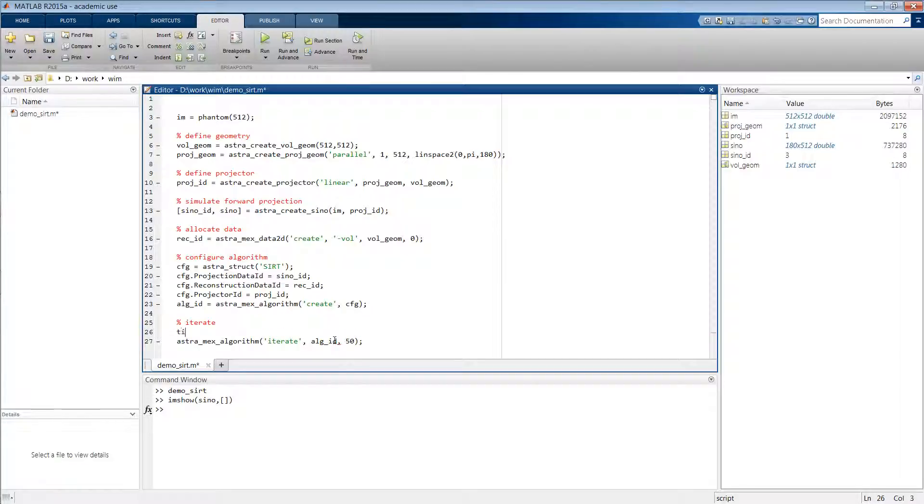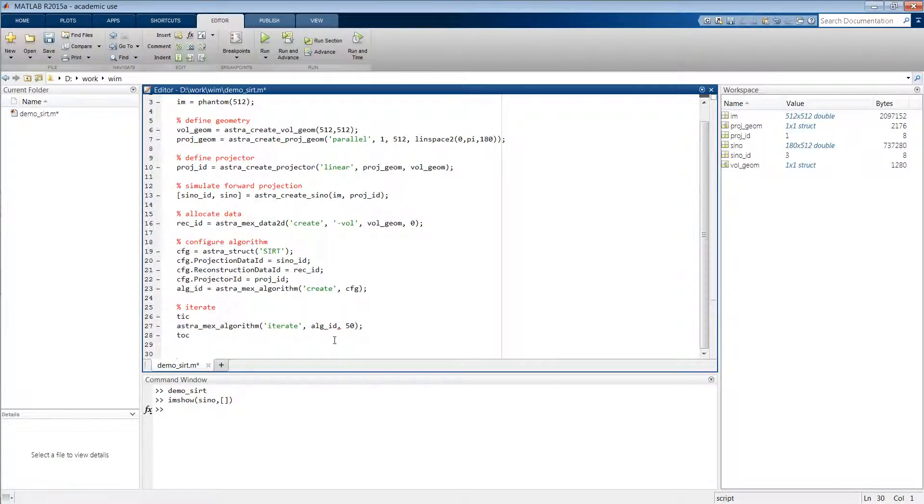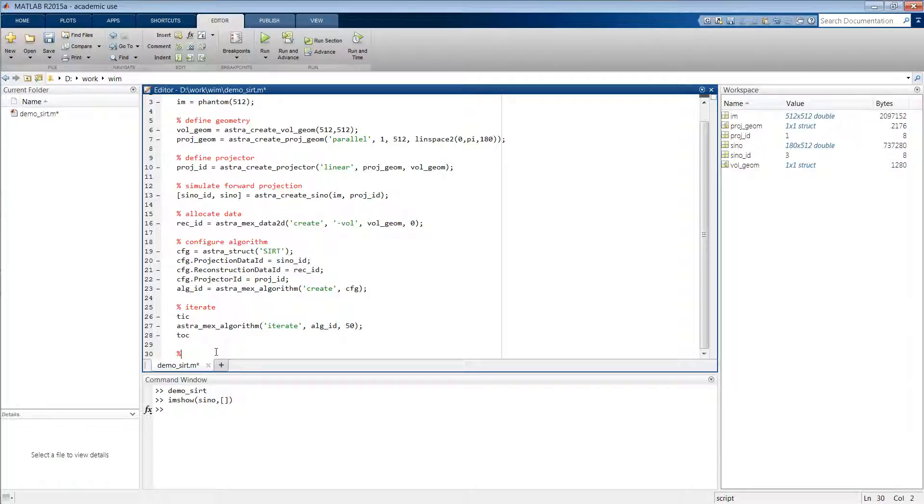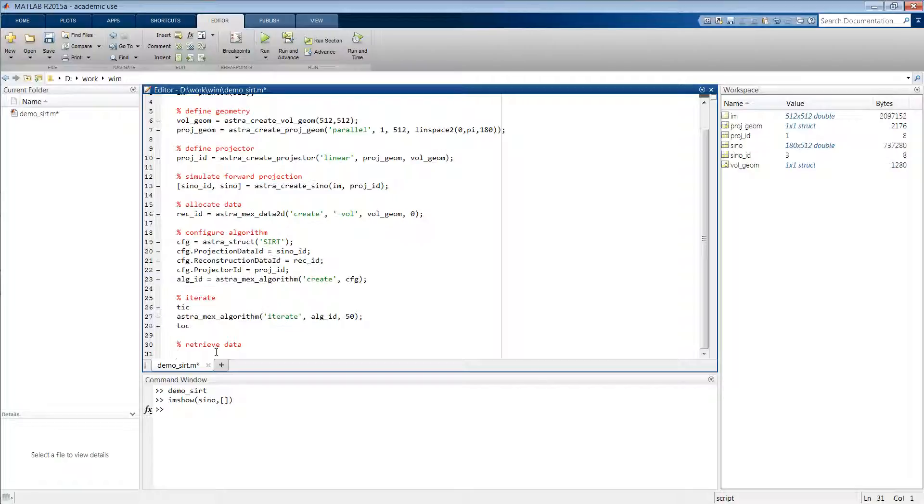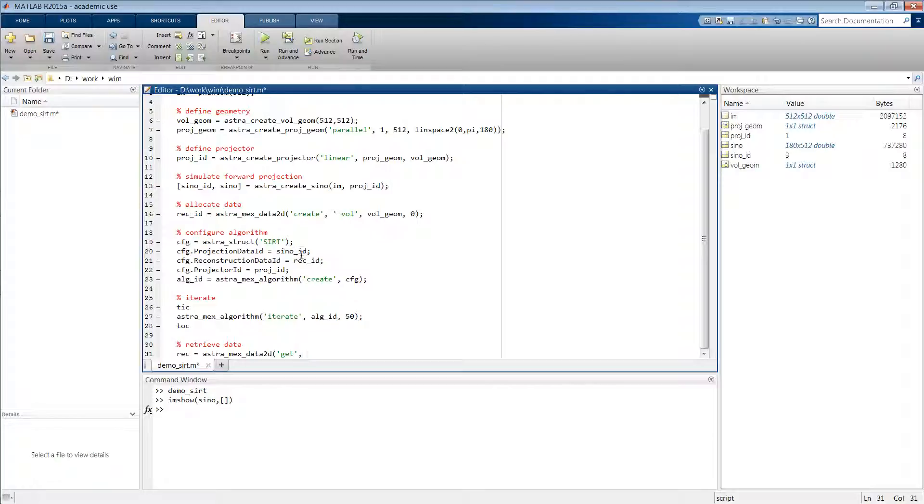Also we will write tic-toc around this function so we can time how long it takes. So then after this iterative process we still have to retrieve the reconstructed volume data into the MATLAB memory. So we'll type astra_mex_data2d('get'), the data that is stored in this object.